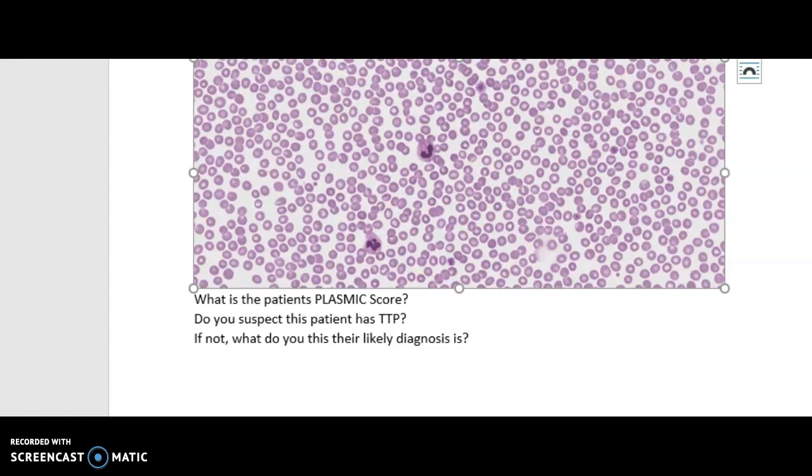So when we looked at Döhle bodies back in Hematology 1, we looked at May-Hegglin, a disorder where people had large platelets and they had Döhle bodies in their neutrophils. I don't have Döhle bodies here in my neutrophils. So I have large platelets, I have a low number of these platelets, and these platelets are functioning abnormally. So what you need to do is go through your lecture and have a look at what's happening there.